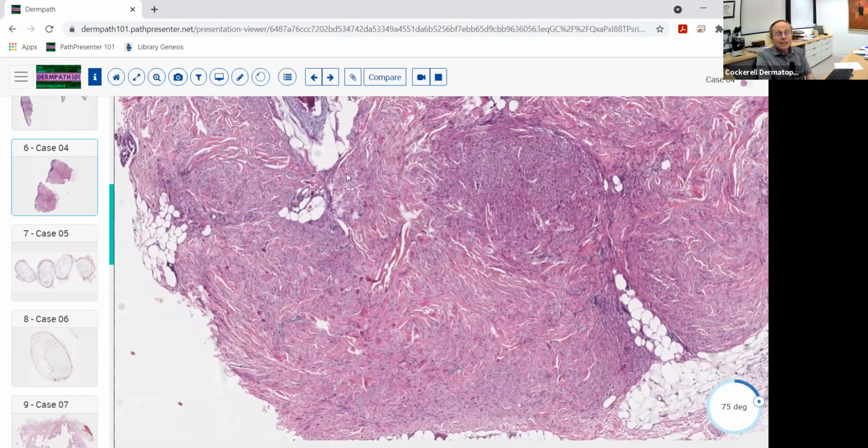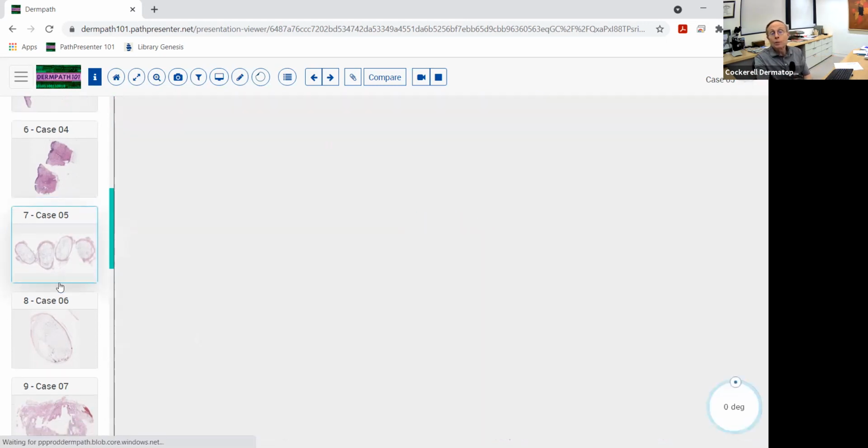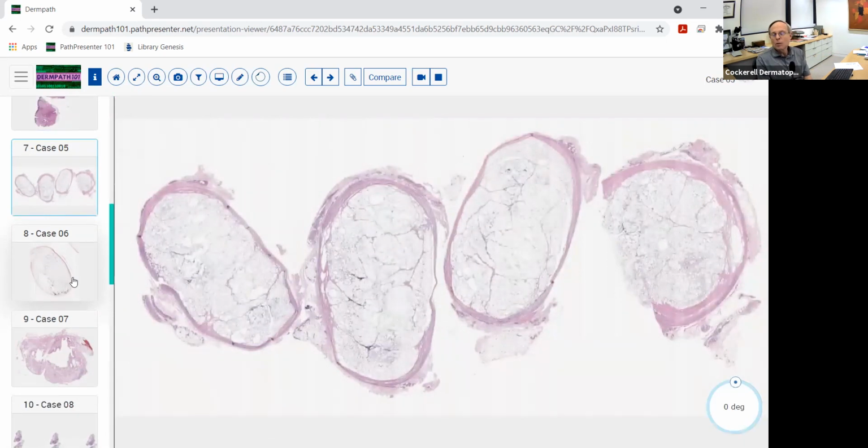Okay, so that's it for muscle. There's really only a few things you really need to know. There's a few other things that are in the family of the myofibroblastic tumors, cutaneous myofibroma, that's also got features of myofibroma, hemangiopericytoma-like morphology associated with those. That sort of falls in this spectrum, but that's pretty rare. Probably aren't going to see one of those in the board examination. But you probably will see a few potentially lesions of subcutaneous fat. Okay, so we're going to switch over to that.